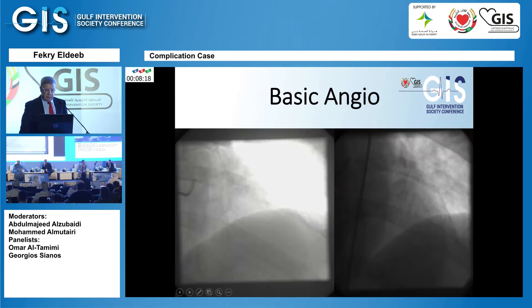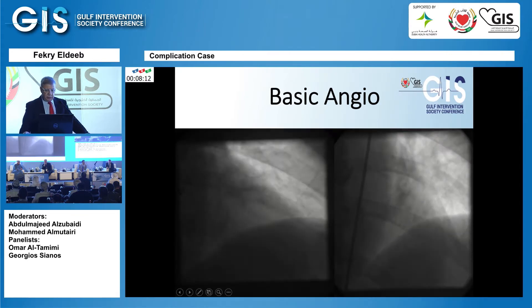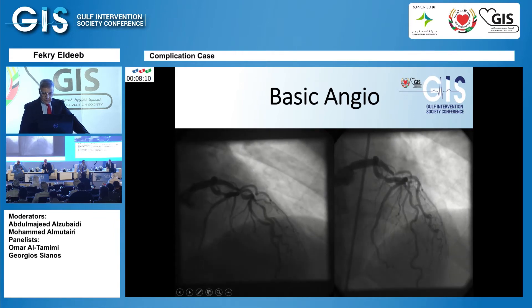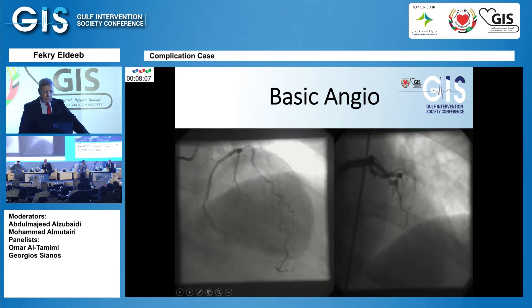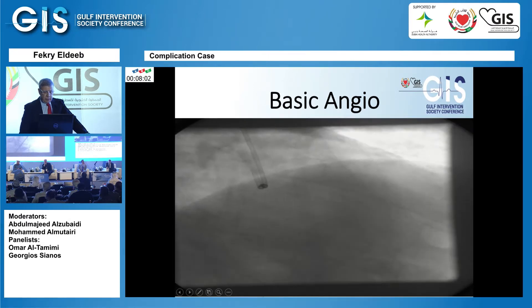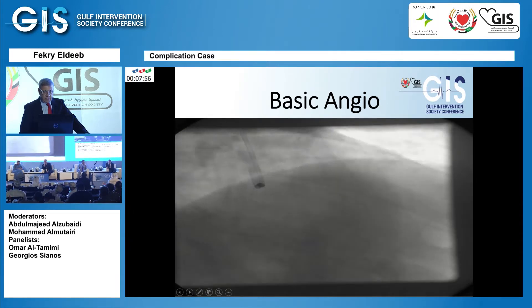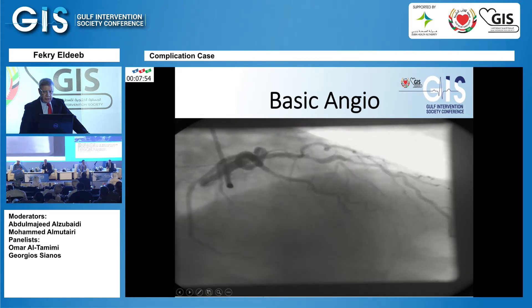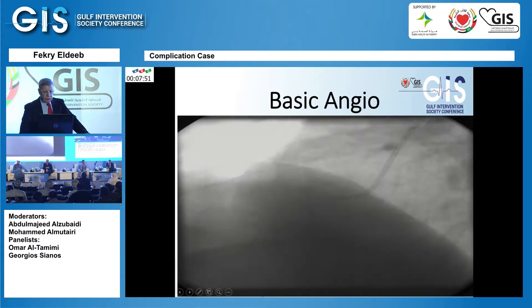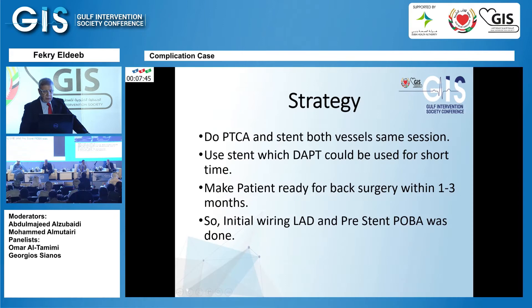This is the baseline angiogram. You can see there is a complex LAD lesion — shown here in different views — it's a complex, multiple narrowing, long lesion with a lot of overlap from other vessels. This is probably the best view; you can see the extension of the lesions. She also had a mid-segment significant right coronary artery lesion.